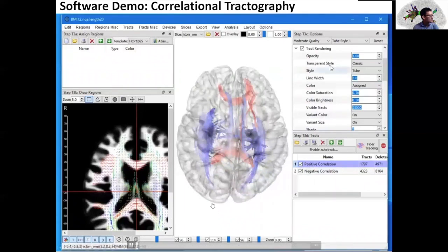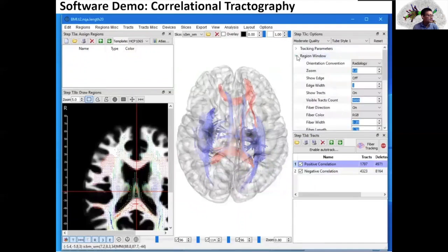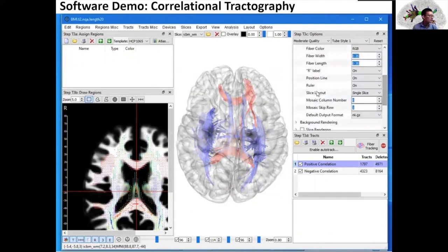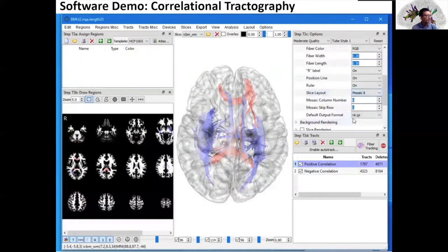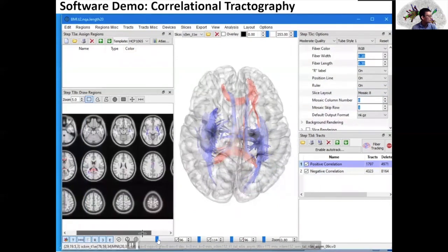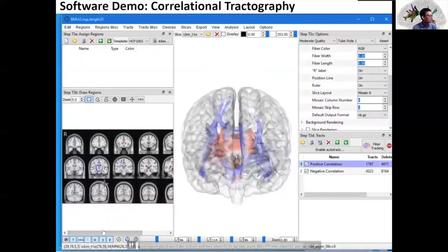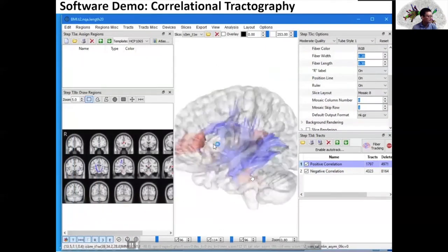On the left-hand side, you can see the slice locations. There's another way to present results in a mosaic view. This would be nice for publication purposes. If you want to look at where those findings are located, switch on the right to the mosaic view. You will see how tracks are plotted across the T1 weighted image, and it helps you to identify the anatomical structure and all the findings.